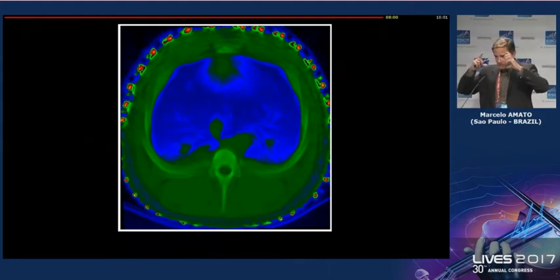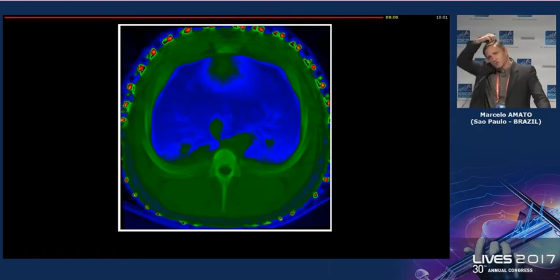When we measure these variations, it's very good to have some estimation of the stroke volume, but to get absolute numbers, we realize that this depends on the elasticity of the vessels. So to get absolute numbers, we prefer to use the saline. This is the only reason. But to get relative distributions, it's okay.